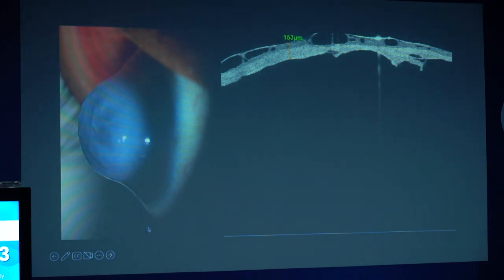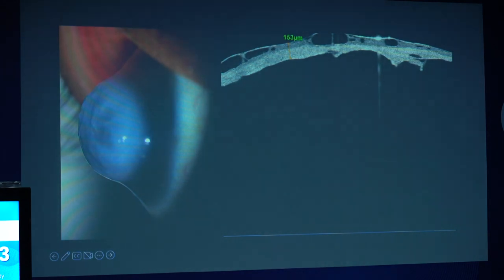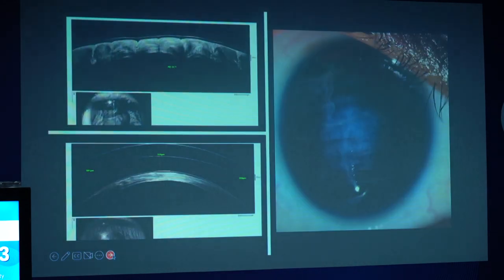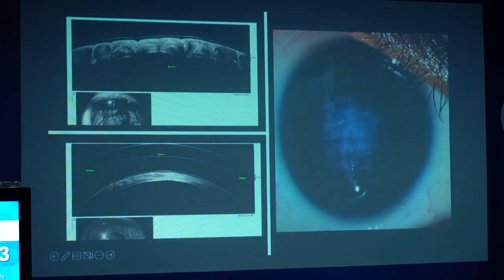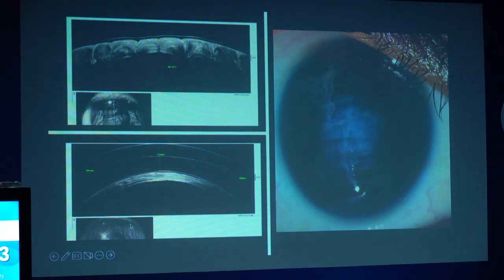This is a patient who developed severe hydrops. You can see on the OCT how the cornea is extremely thin at nearly just 153 microns, and the Descemet's membrane is not even visible here. On sequential follow-up, this patient underwent compression sutures — you can see the stroma is quite compact. At the last follow-up after nearly two months, you can see a well compacted and scarred cornea.